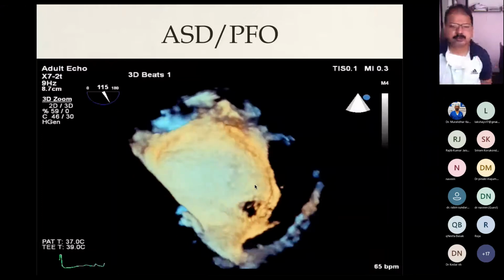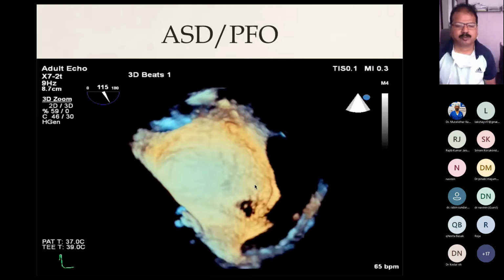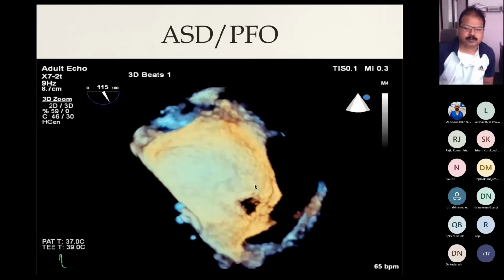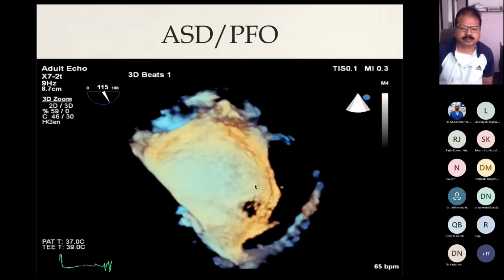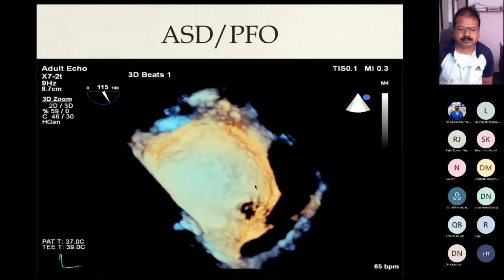And still, with all these measures, sometimes the ASD is masked. Still, we don't see the small ASD or PFO. Actually, it's there. So sometimes what the surgeons do is clamp the pulmonary artery to raise the RA pressure and see if there is a PFO or not.